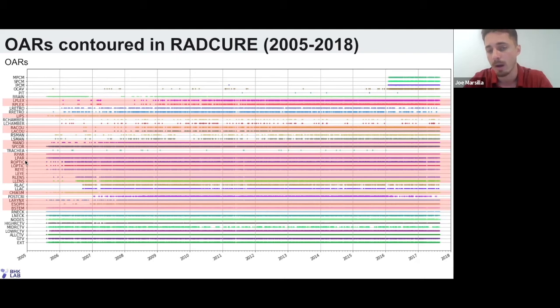Another class imbalance problem is the amount of voxels the specific OAR covers. Keep those two issues at the forefront of your mind. Your network should be able to leverage these labels across all patients to segment all 34 OARs that we have listed.